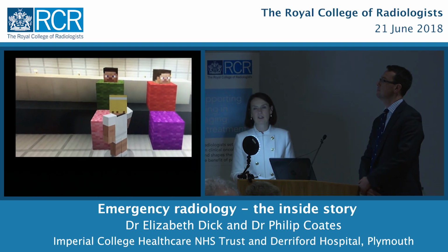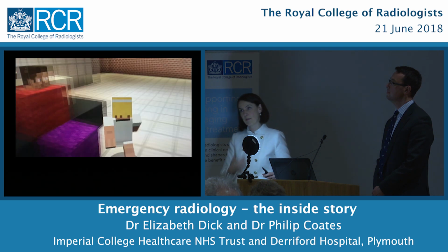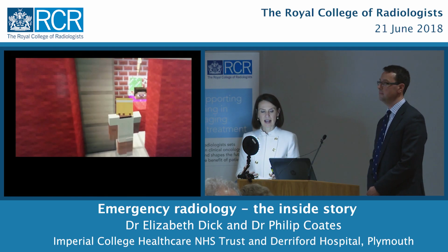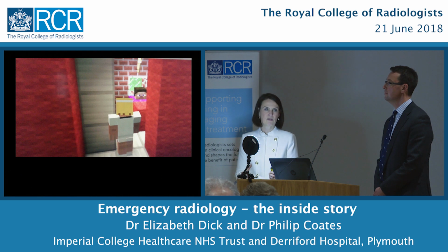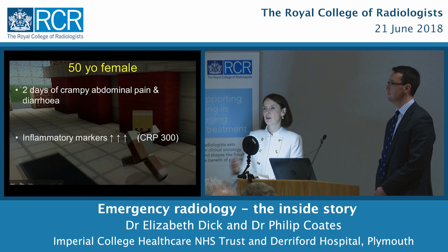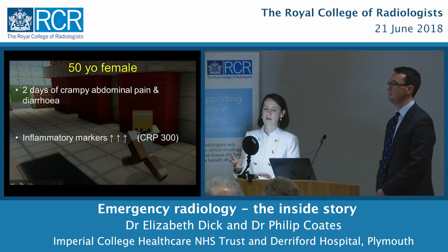Now, when I was a junior doctor 20 years ago, people who came in with abdominal pain, it was pretty straightforward. They went straight to theatre and they had a big scar, a big operation to see what was going on. And the radiologist wasn't really involved, but now things have completely changed and we really are involved. And I think so much for the better of the patient that we're involved. We're called for our opinion. So this lady that we're going to look at, she's got crampy abdominal pain, she's had diarrhea, and looks like there's something going on in her abdomen, some inflammation.